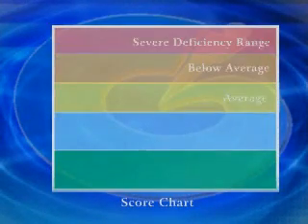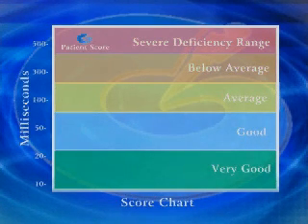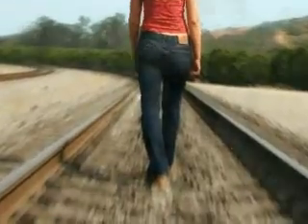The IM objectively measures the patient's ability to stay on the beat. The measurements are given in milliseconds and a score is provided. The results are an indication of the patient's motor planning and sequencing abilities. Through years of research, we know what the normative ranges are for the various age groups. Therefore, after a brief assessment, it is clear where the patient falls in their age category.